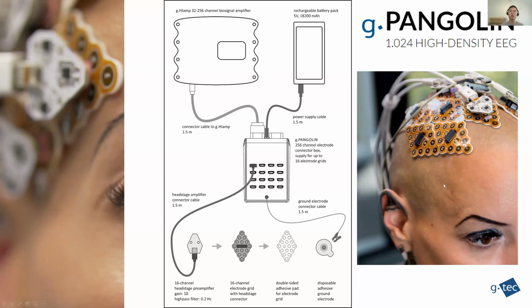A Japanese group did this research mapping the language system. They place a book in front of the subjects, asking the subject to read the lines line by line. At the same time, they're tracking the eye movement using EOG channels around the eyes, monitoring the heart rate too, and monitoring the language activation. So it's really interesting research doing high density grid.